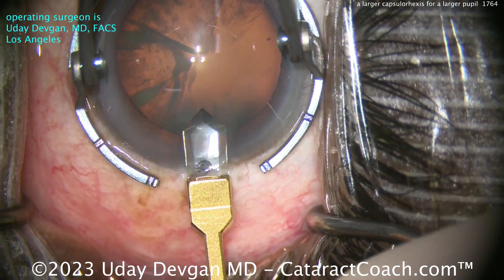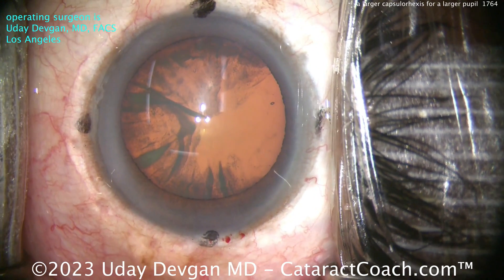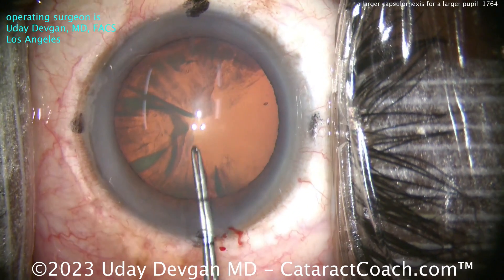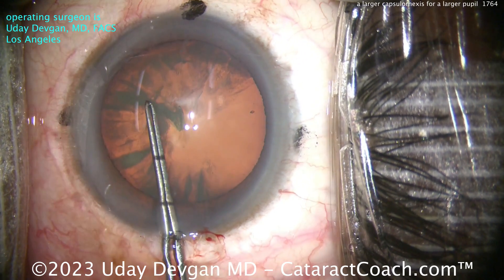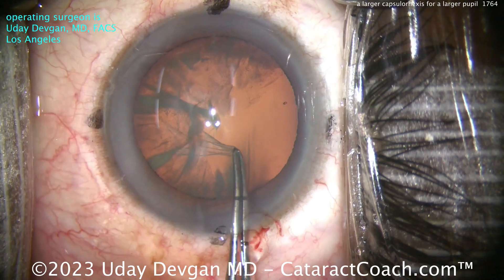The patient enjoys the larger pupils and likes to be a little bit myopic. As a result, the patient is very happy with the current state of vision other than the development of cataracts over the last few years. So I'm measuring there with the forceps and I'm going to start off getting our rhexis done. I want to aim here for a little bit bigger rhexis.